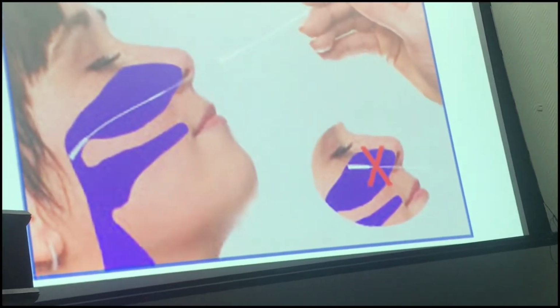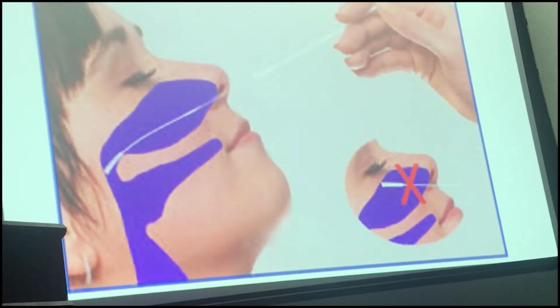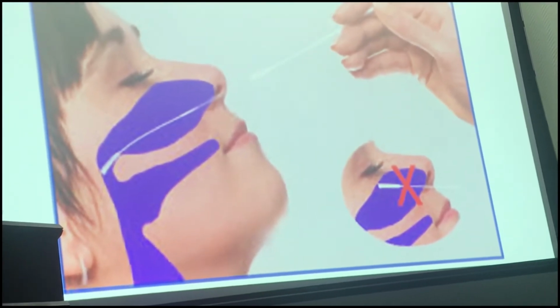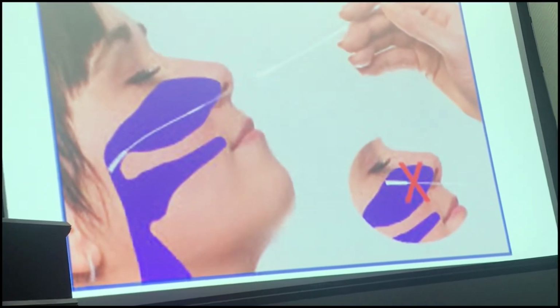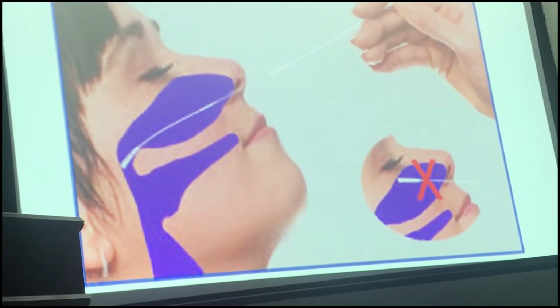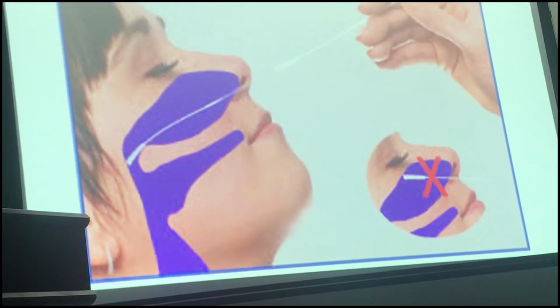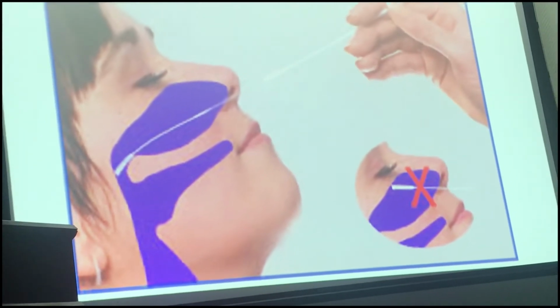As I mentioned earlier, the hands tend to go up, like the picture down there. You feel that you're going down, but it always goes up. So always put in an effort and push the tip down while you're going in. Push down and forward till you reach the resistance and the distance. So two things: the distance and the resistance.